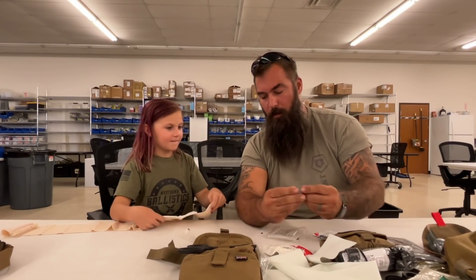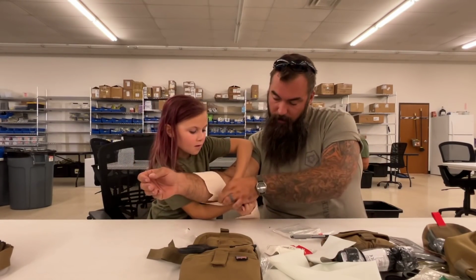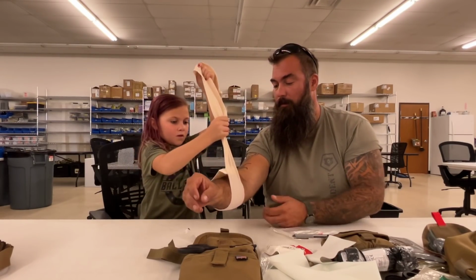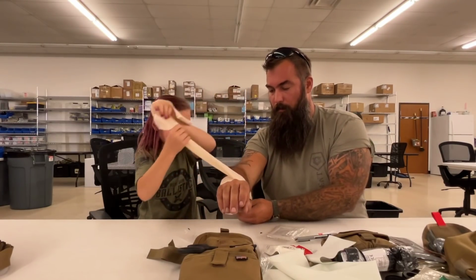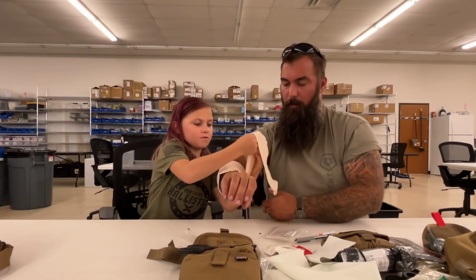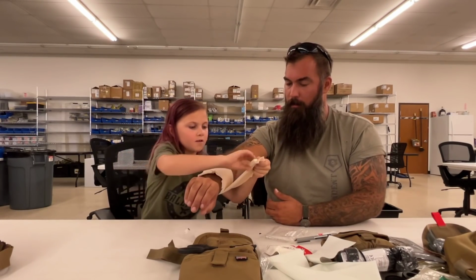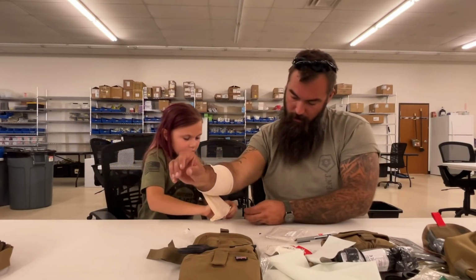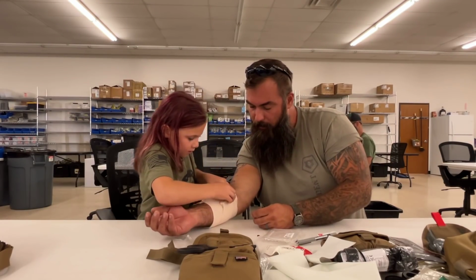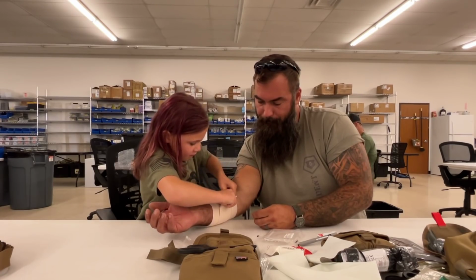Okay, so you're gonna put the gauze down, right? Use that first bit of Velcro right here just to get it started. Now pull tight. Okay, pull it tight. Good, come around. Pull it tight again. Good, wrap it around, pull it tight again. And then see those clips right there? Exactly. Look at this, intuitive. You're going places, kid.